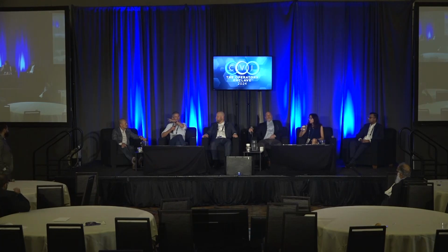I was thinking that exactly, because you put a 30 in and there was still a leak. And it's aneurysmal, so obviously the primum is coming back like an accordion, and there's a big space. If you could do this from the groin, it would be very reasonable to balloon size, and actually you could put an ASO in, and I'm sure this thing would balloon stretch to at least 15 millimeters or more. But from the neck, you're just trying to get in and out, and the balloon is another risk. Was that your thought?